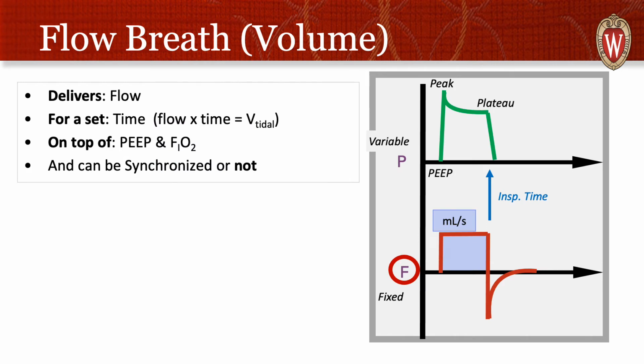What you see in textbooks, however, is not an inflated balloon, but this more complex drawing of a peak pressure and a plateau pressure. What does that mean? Well, the pressure is sensed at the ventilator. However, the alveolar balloon is still getting inflated under that waveform. You just can't see it because the pressure sensor is right by you at the ventilator.